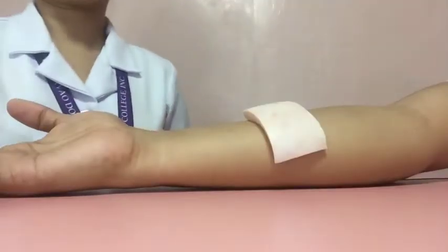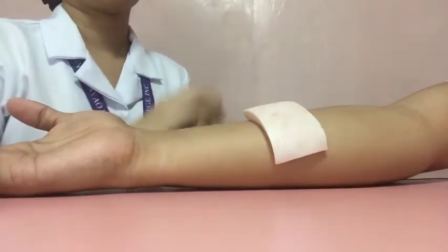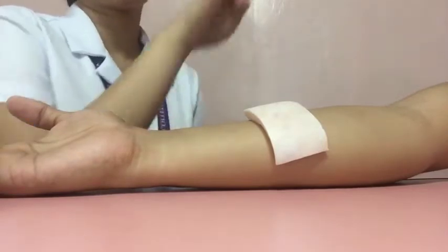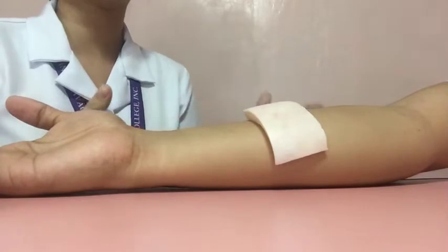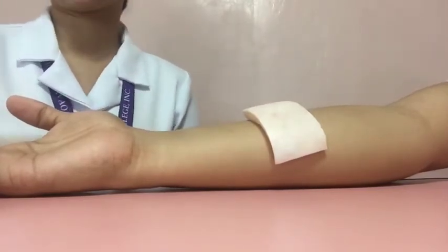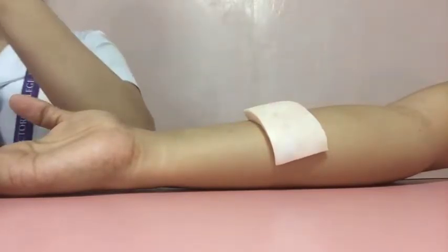So now let's select a site, a forearm about a hand's width above the wrist, or 3 to 4 fingers below the antecubital space. So avoid using sites that are tender or swollen or have lesions. So apply clean gloves as indicated by the agency policy.